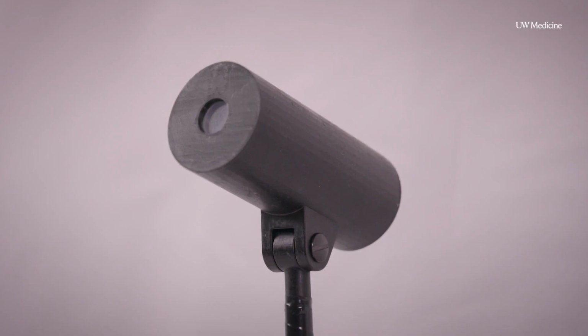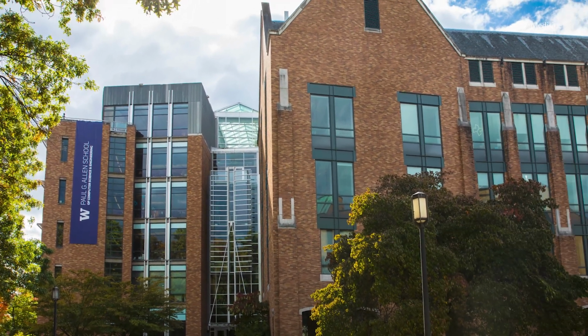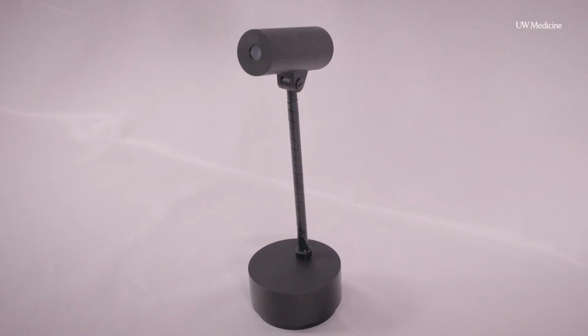This device was created through a collaboration with the University of Washington's Paul G. Allen School of Computer Science and Engineering. So this is a Beacon device. It's used to administer what's called the critical flicker frequency test, which is basically the speed at which a flickering light would appear like it's not flickering to you.